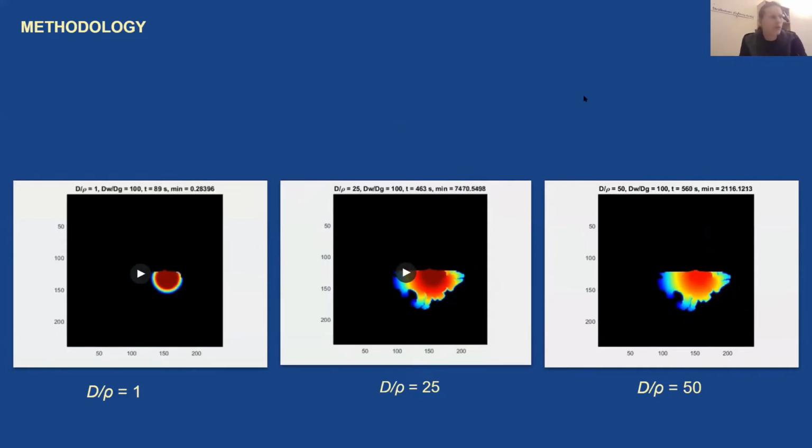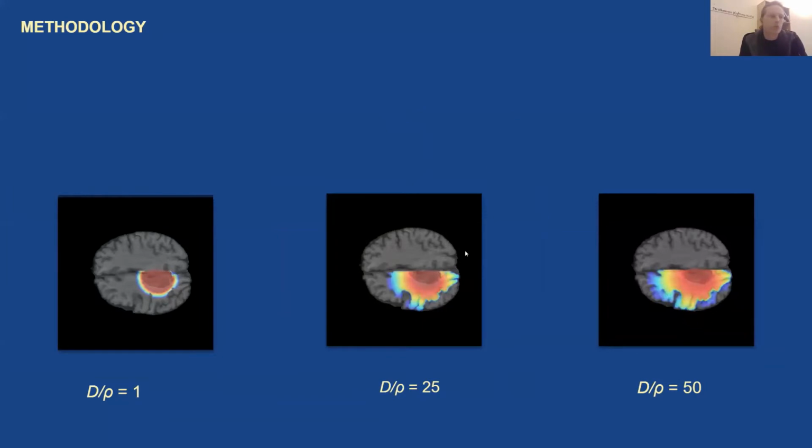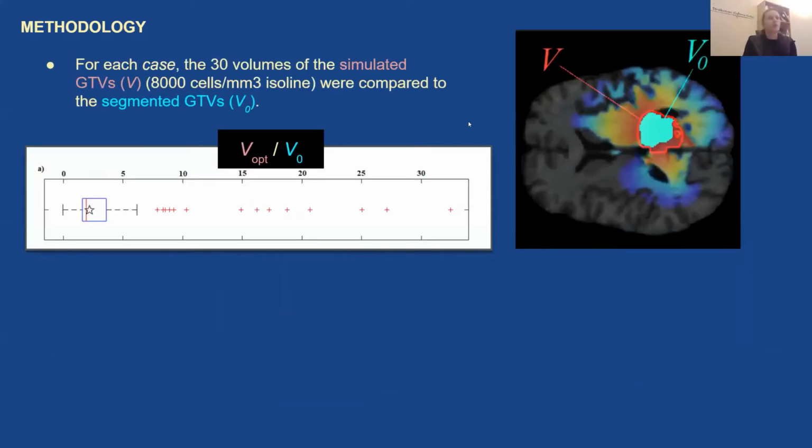So the result is, when we overlay this, we get some sort of tumor distribution. For each case, we got 30 different simulated GTVs. Notice this is a lot to keep track of. Anyway, this is important because we took only the best ones. So we looked at all the different volumes of the simulated tumors and compared them to the ground truth volume. We took the best one, we call it the optimal, and here's what the distribution looks like for all cases.